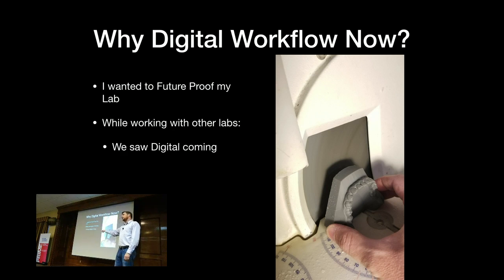In fact, that SculptCAD company, I was doing splints for them because they didn't have a resin yet that could stay in the mouth for 24 hours. So they would print these surgical guides, and I would duplicate them and turn them into using ortho acrylic that could stay in the mouth, and they'd wire them all shut.